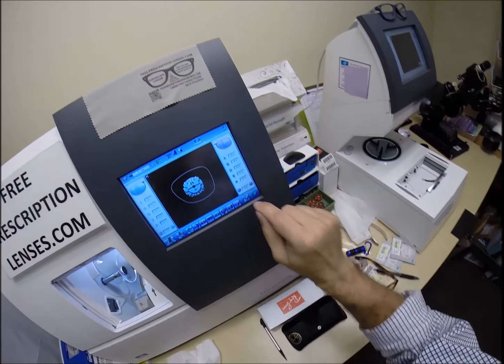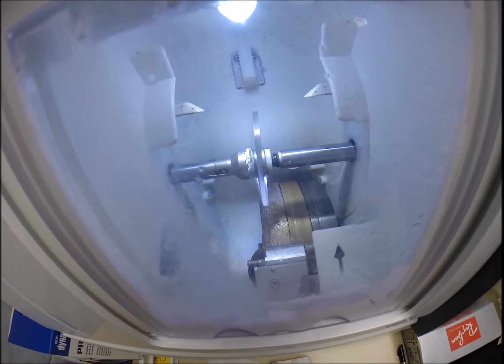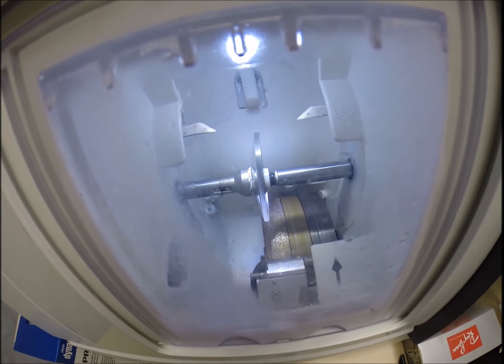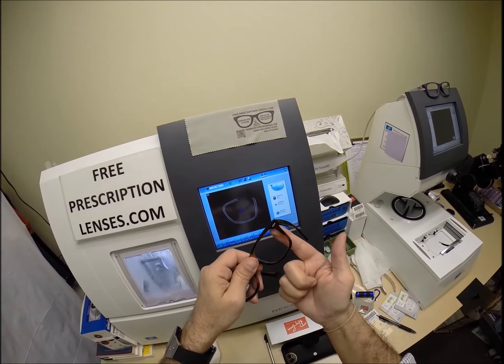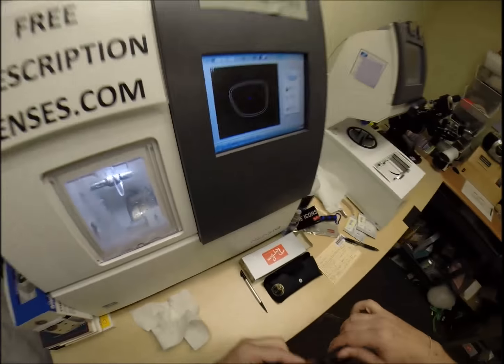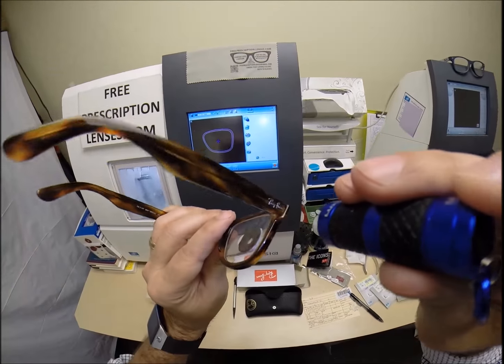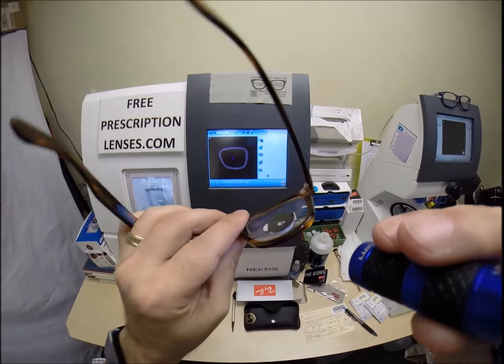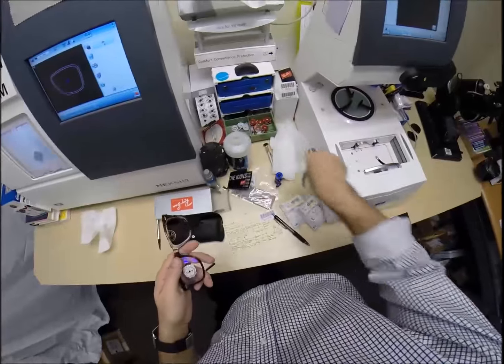We're over on L. Hit the green arrow, which is start in every language. The door closes, the clamp shuts, and then the lens is going to be traced again by the 2 white styluses, making sure that it's large enough to fit into the frame. You can see as it's going around tracing the shape of the frame. And the old saying, measure twice, cut once, is measuring the thickness of the lens at every point to know exactly precisely where to place the bevel, so you have the least amount of edge thickness showing, of which you got none. You got no edge thickness. How about that? So we can go ahead and continue working on the right.